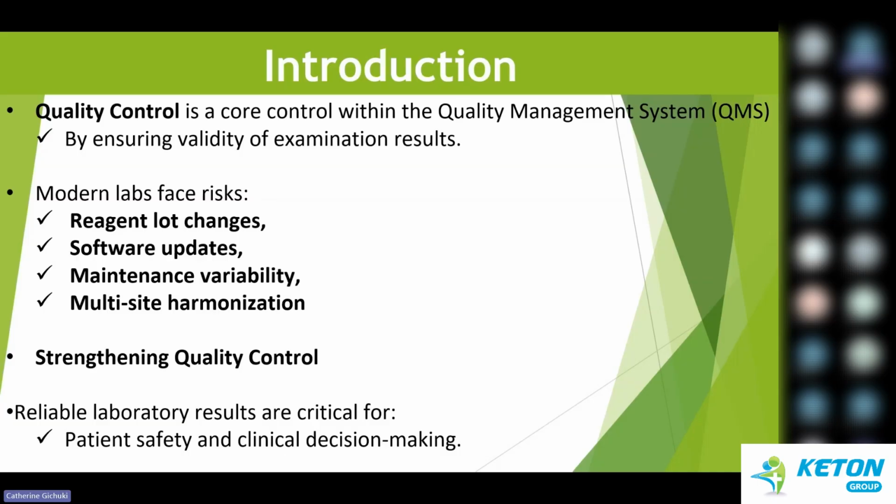So this is required because our modern labs face a lot of risks. If we start looking at risk in depth, we might go into much depth, but the risks that we want to envision are those pertaining to our operations. For example, reagent lot changes. We are changing lots of reagents every day. It's something that is inevitable, so that is a risk on its own.